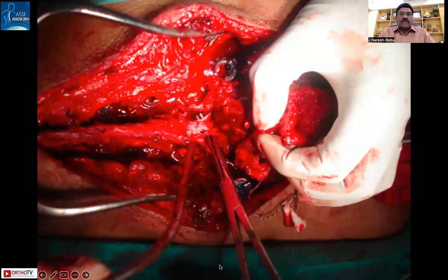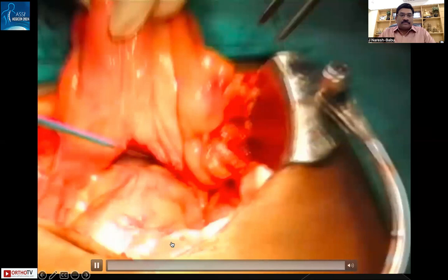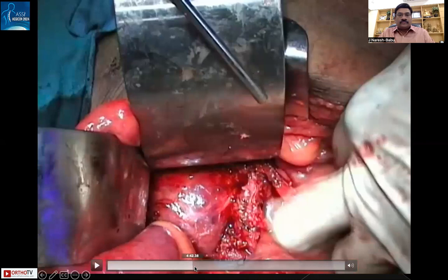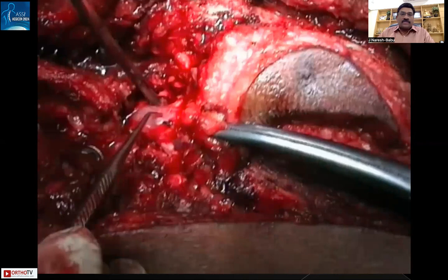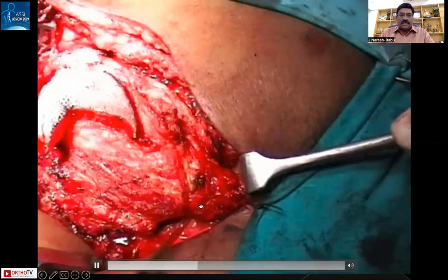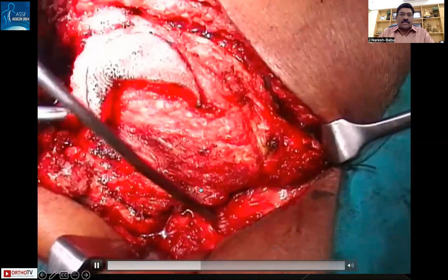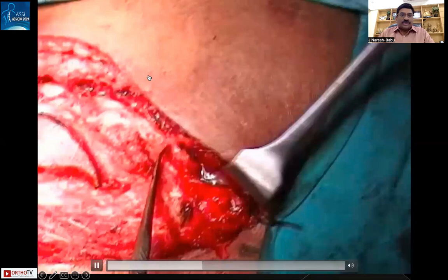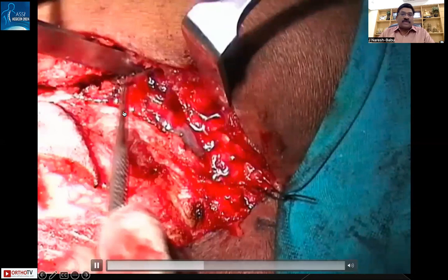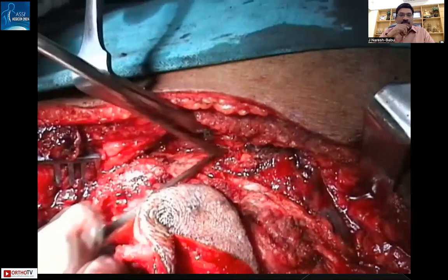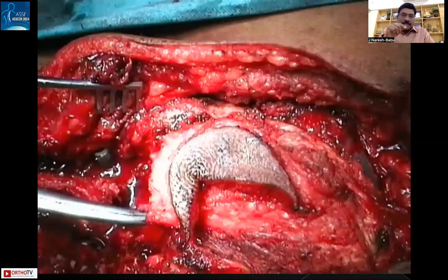After completing the anterior stage, the posterior procedure is shown here. The thecal sac is exposed by laminectomy. The anococcygeal ligaments at the distal sacrum are separated along with the sides of the sacrum, and the sacroiliac joints are osteotomized. A retroperitoneal fat pad is seen from the posterior. Circumferentially, the tumor is separated — some infiltration of tumor has breached the sacral cortex and extended outside the bone.